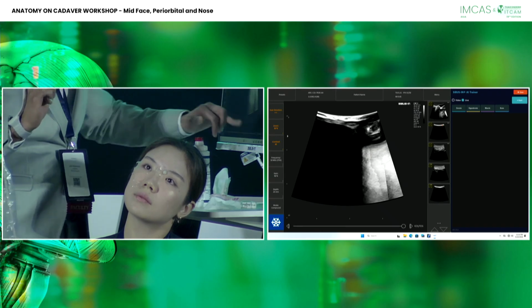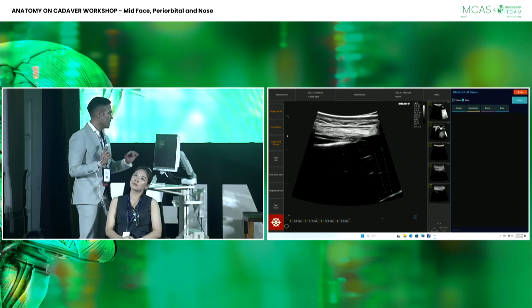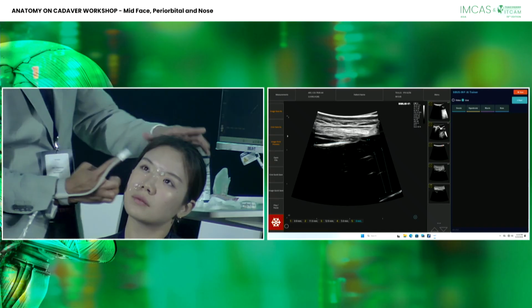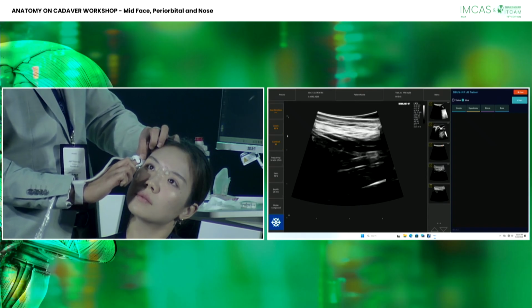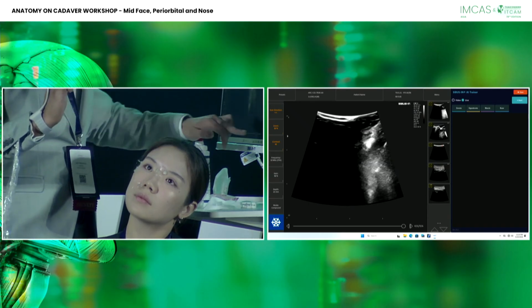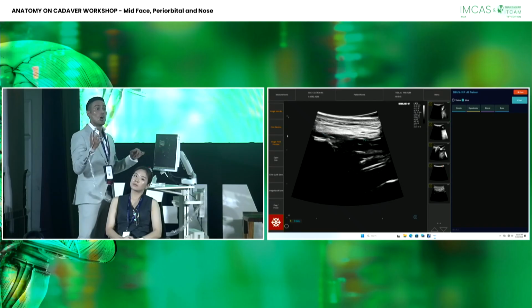And you see it here actually very clear. This is the zygomatic bone. This is here the temporalis muscle. And this is the temporal bone. So your filler will slip actually at the level of the intermediate temporal fat pad. Let me show you this. Roya just demonstrated this very nicely. And here is the intermediate temporal fat pad on your right, that hypoechoic, almost anechoic looking area. Here is the zygomatic arch, the bone, and when you place the filler here, it will slip in this area, right? So you are also filling the temple.